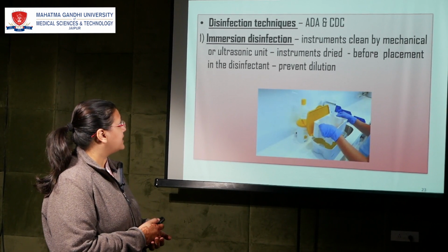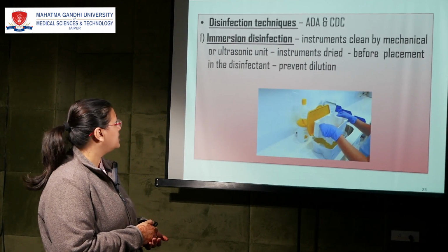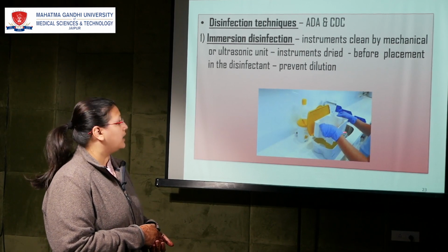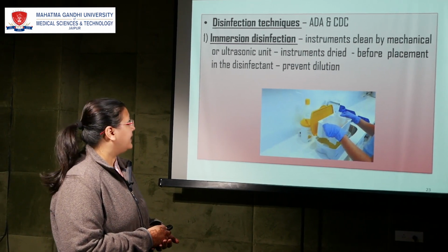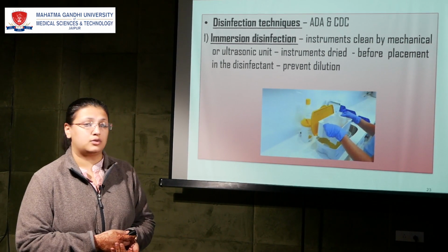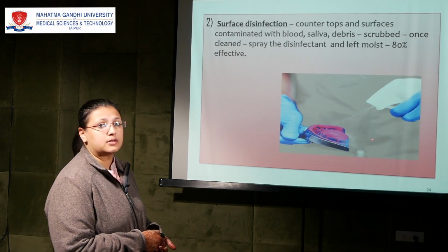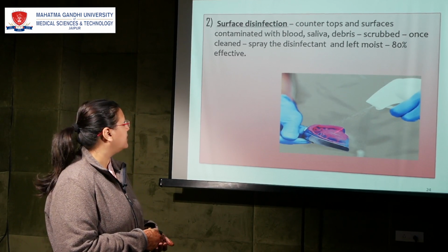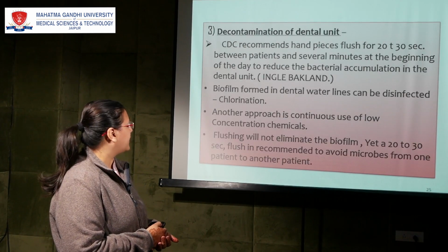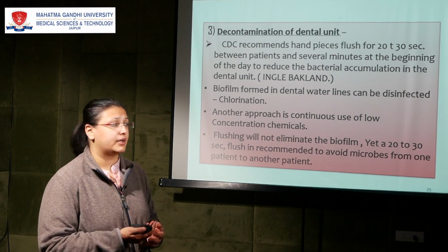So disinfection techniques can be classified by ADA and CDC. Immersion disinfection, that is the instruments are cleaned by mechanical or ultrasonic units and then instruments are dried before placement in the disinfectant to prevent dilution. Then surface disinfectant, that is the countertops or surfaces are only sprayed with the disinfectant and left moist, so 80% effective. Then comes the decontamination of the dental unit.